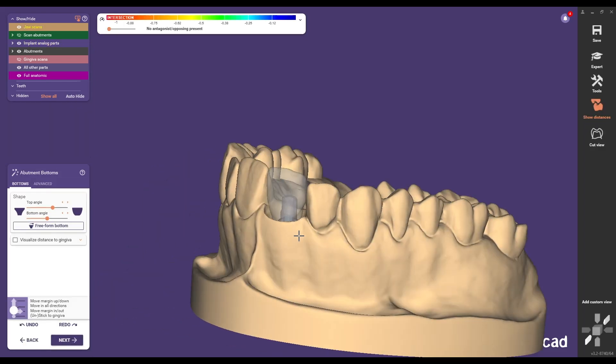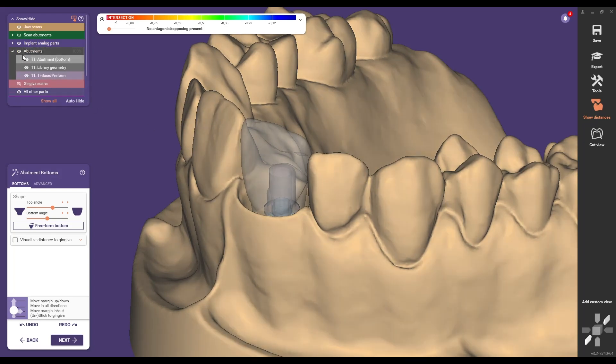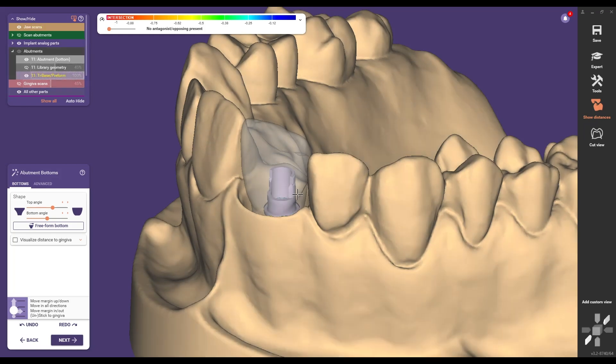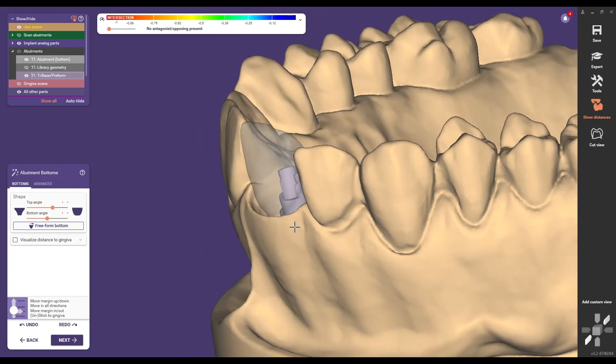At the abutment bottom step use the new angled screw channel feature in ExoCAD Elefcina 3.2. The open window of the titanium base is positioned labially and the screw channel angulation is carried out in this direction only.